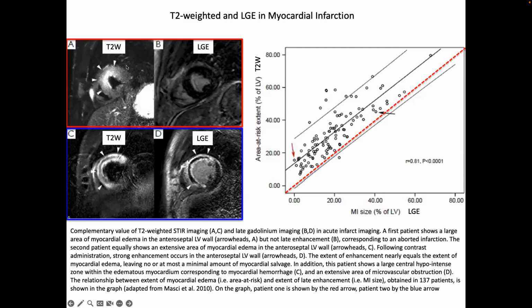Well, this is an acute infarct by the look of it. But anyway, you image the T2 as a function of position in that tissue, and you get this really bright spot. That means the T2 got really long, right? When it got really long, what does that mean? It means the tissue is swelling up.